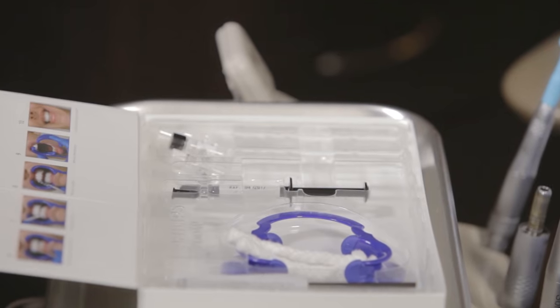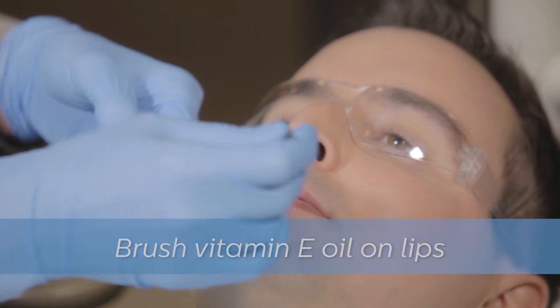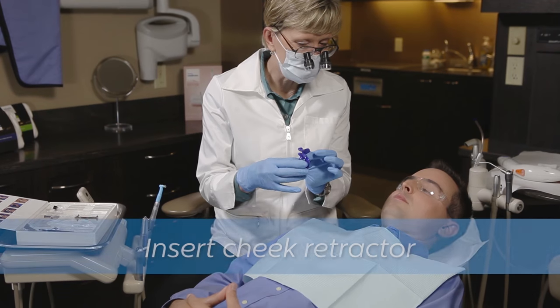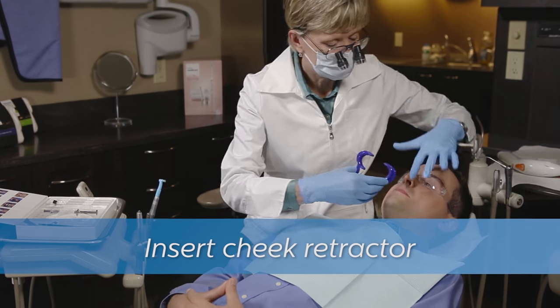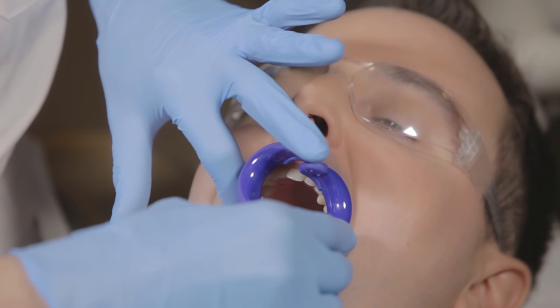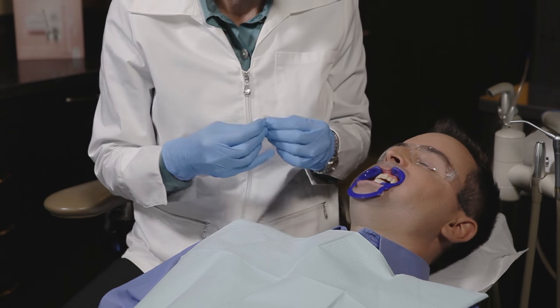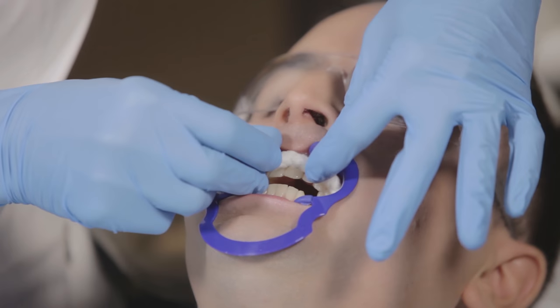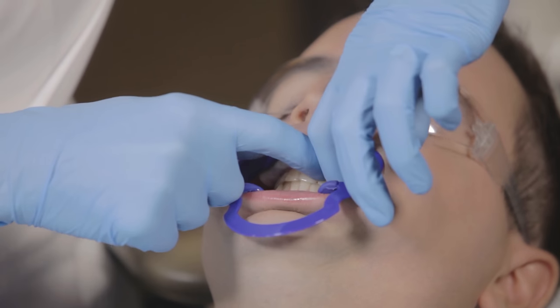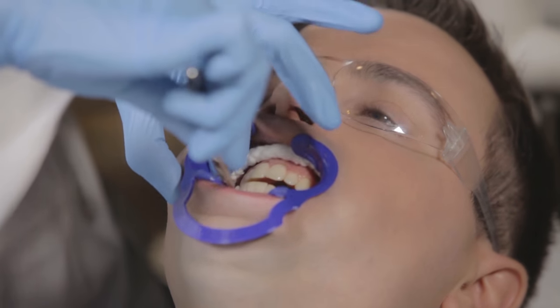First, make sure the patient is wearing protective eyewear. Then apply the provided vitamin E oil to the patient's lips to help maximize comfort during the treatment. Next, insert the provided lip and cheek retractor. For some patients, the retractor may fit more comfortably with cotton rolls added. If needed, insert the provided cotton rolls into the patient's vestibule areas, taking care to tuck the corners in completely. Two rolls are provided in each patient kit — one for the upper and one for the lower.